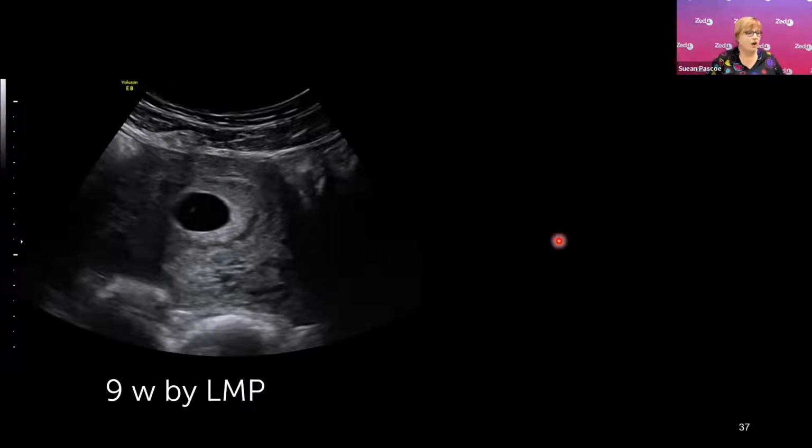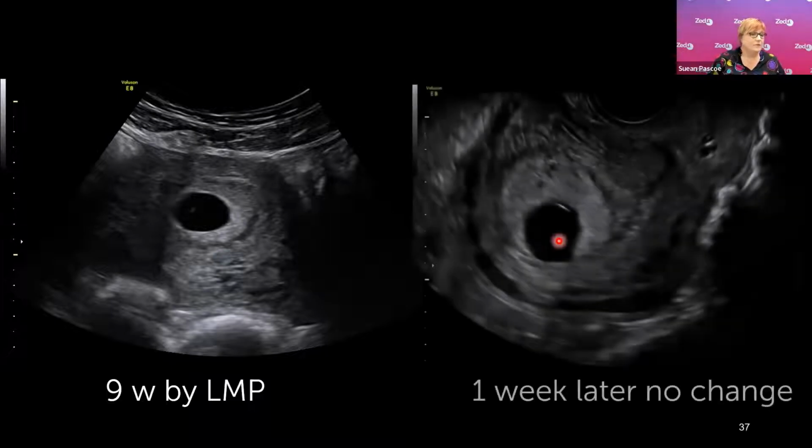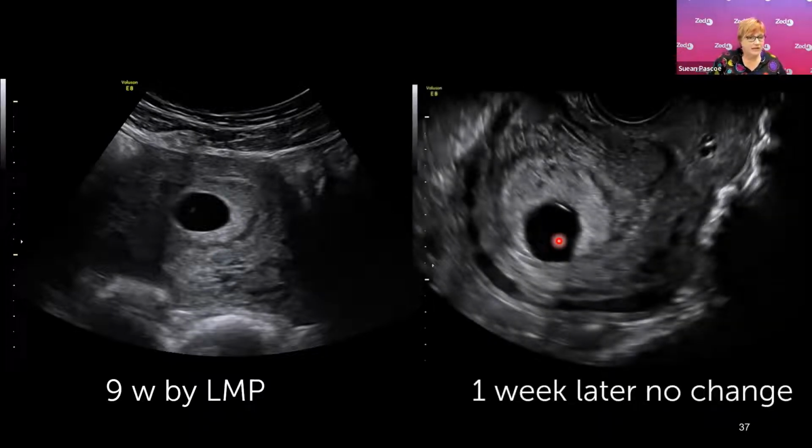So this patient was 9 weeks by dates, and when we scanned her, it looked quite early. And then a week later, we scanned again, and there was no change in the pregnancy. So we couldn't see the yolk sac, we couldn't see the crown rump length. And so now we can categorically call this that it's a failed pregnancy.